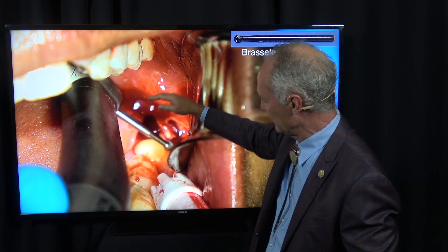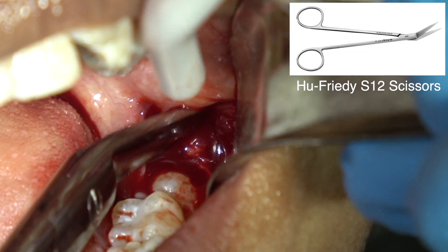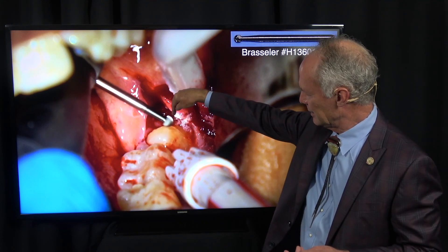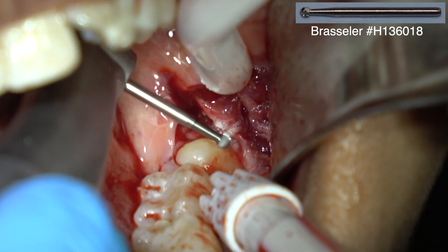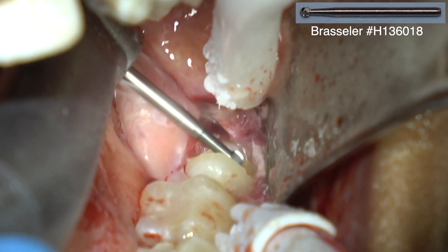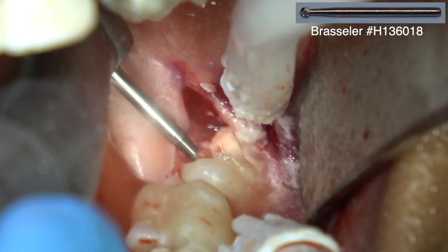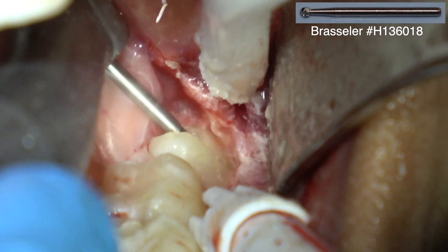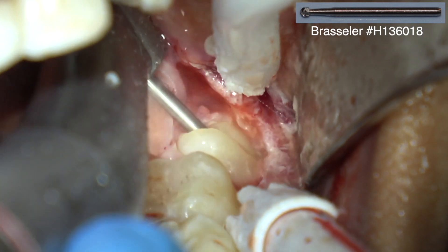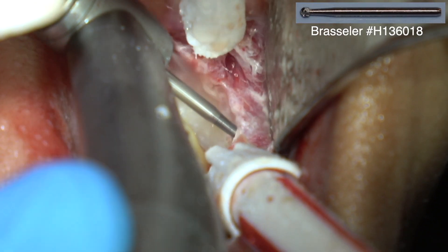I need space to move the tooth into, so cutting the tooth also creates space. The tooth is pointing in this direction, so I want to remove the coronal part and then move the apical part into that space. I'm basically cutting the crown of the tooth off — the roots go back that way. Using a number four long shank round burr, you want to cut at least three quarters of the way through the coronal part of the tooth so you can elevate and just pop that part off.